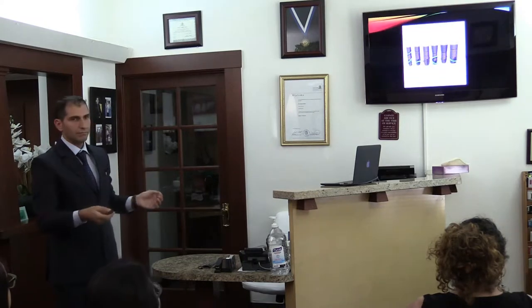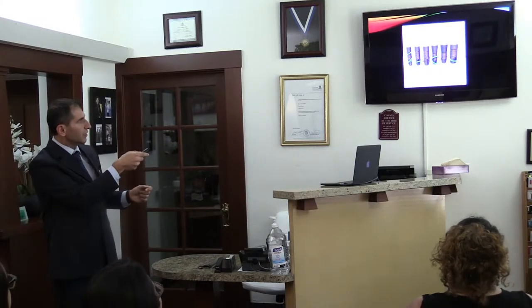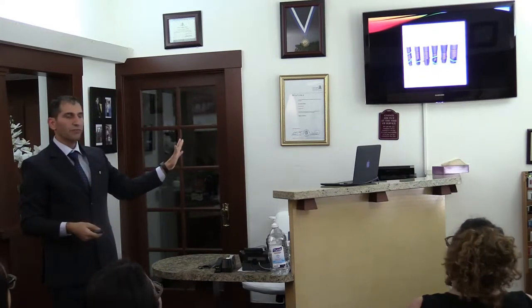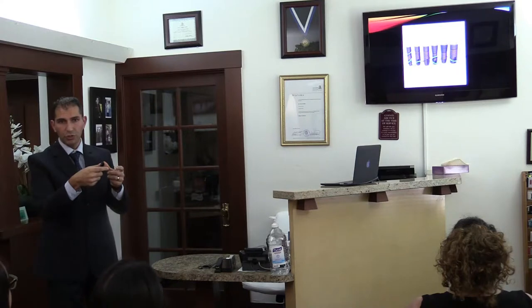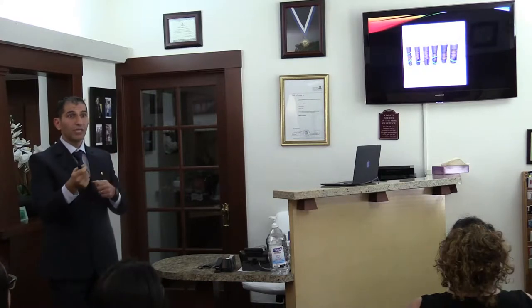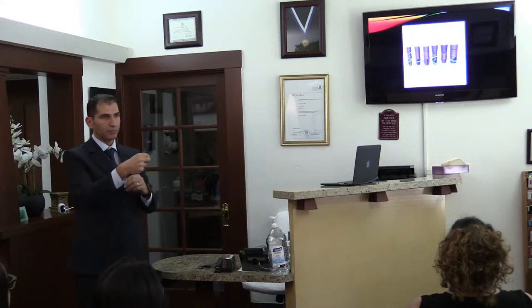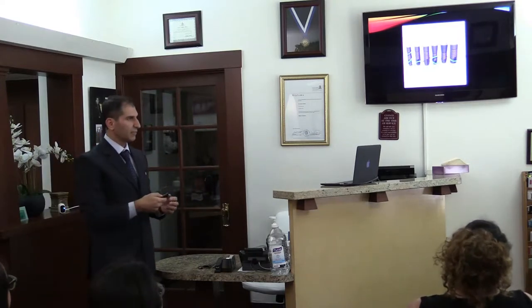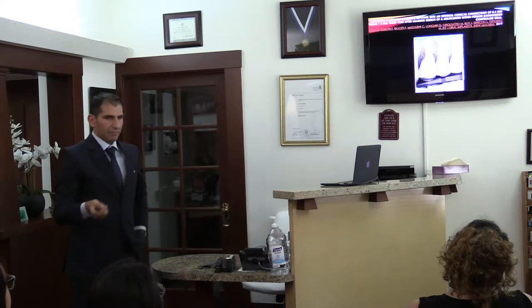And the whole business, I'm sure you guys are familiar with this famous type of implant. You can see the rough surface, then 1 millimeter is a polished collar, higher. The reason why we have that 1 millimeter higher than the bone is because of the connection, and we don't want any kind of pumping effect from the connection and microleakage from that pumping effect. So we're trying to put the micro gaps between abutment and implant away from the bone so we can preserve the bone. Does that make sense? Okay, so a whole company did that. But I have a problem.